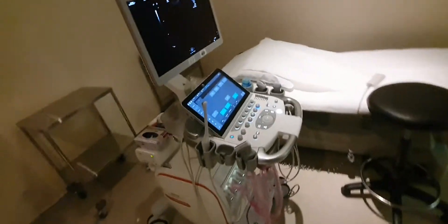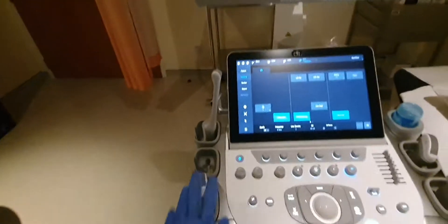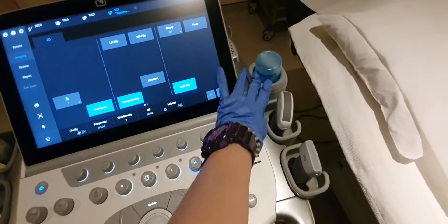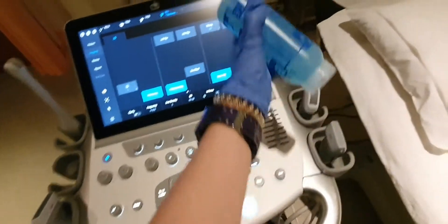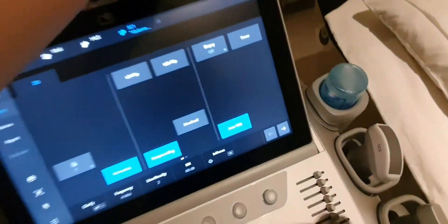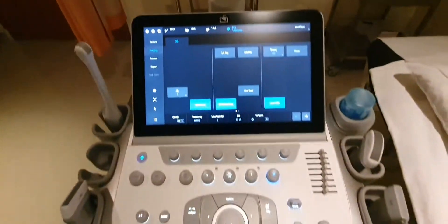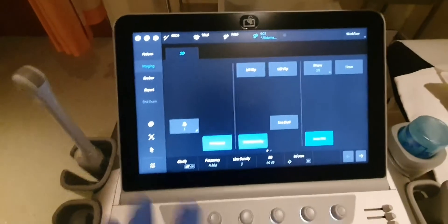This is the whole machine and this is how it looks. We have the probes here — we have four probes — we have the gel with an attached thermal warmer so it will be warm, and we also have the probe covers, gloves, and tissue at the back.